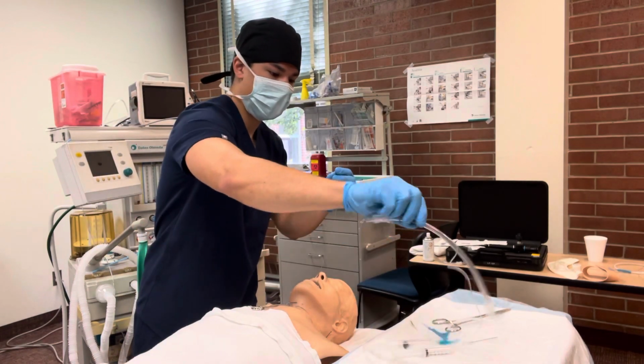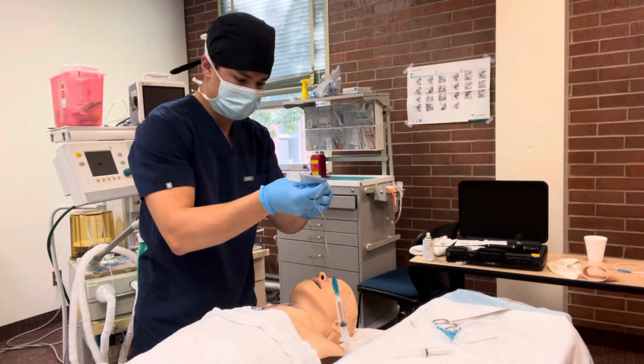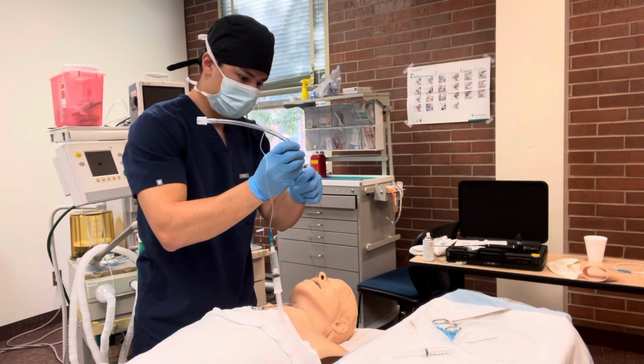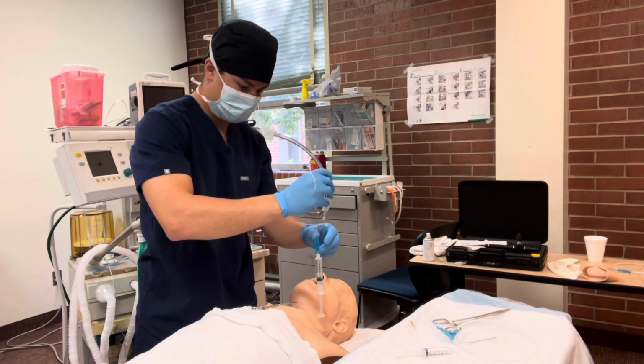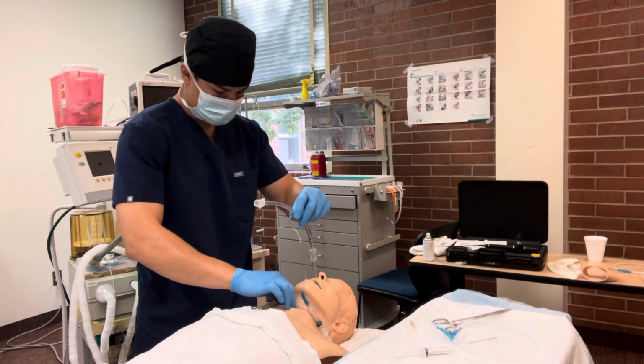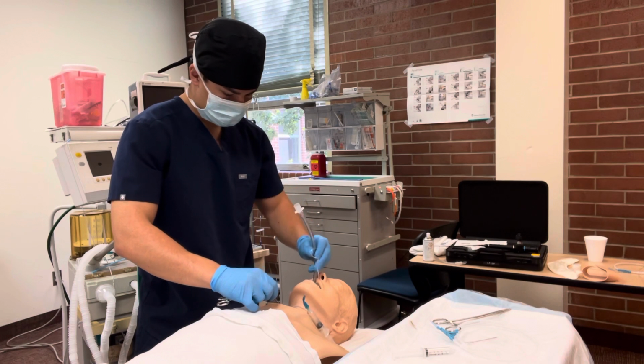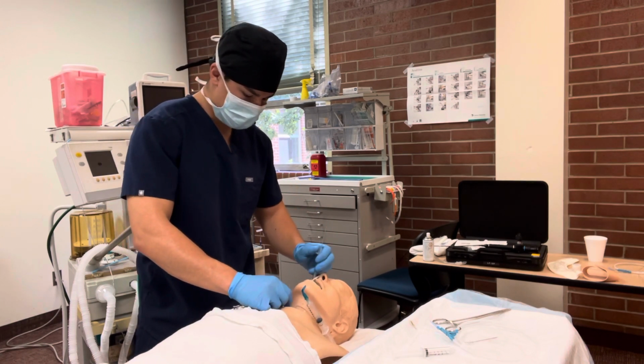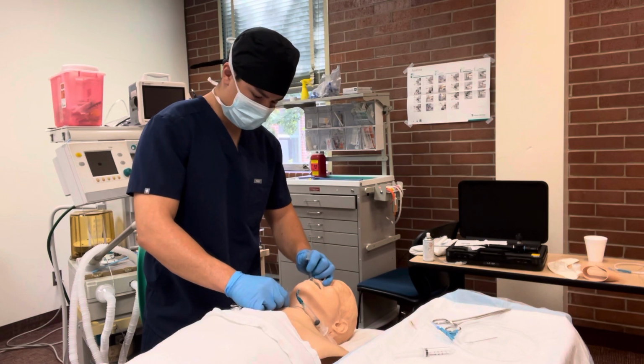I'm going to thread my endotracheal tube over it. I'm going to insert all the way down until I meet resistance at my wire insertion site.